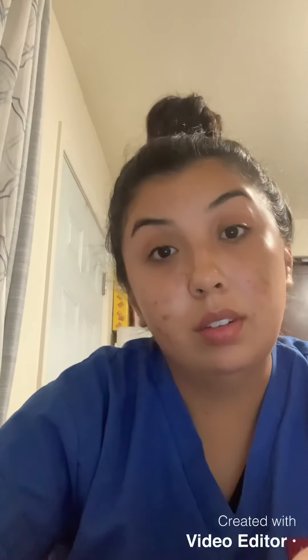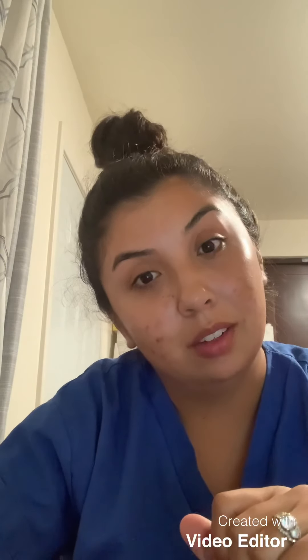Hi, my name is Felicia Garcia. I'm going to be your MA today. I'm going to be getting you started with your vital signs. We're doing vital signs for session three. I'm going to be doing it on myself again because my son's asleep, so it's just me. I might do it on my dog next week. I'm going to start with my temperature.